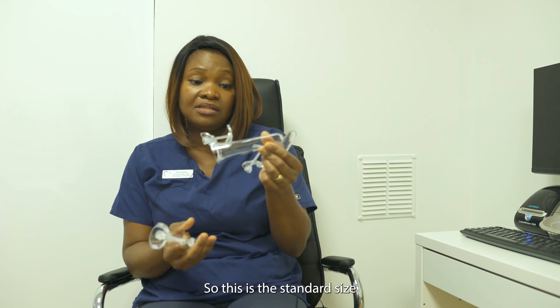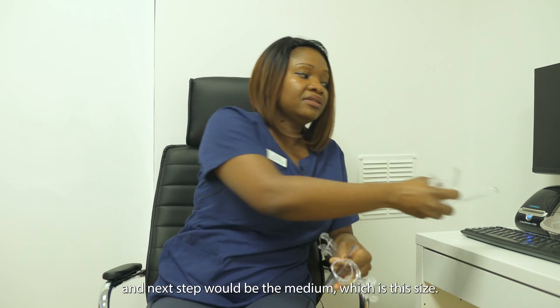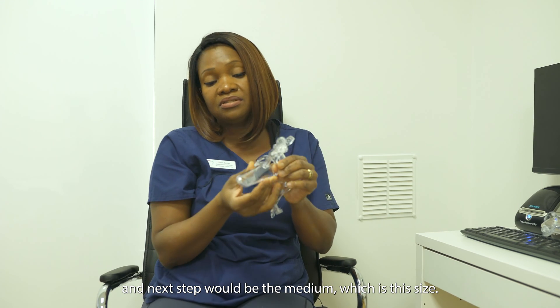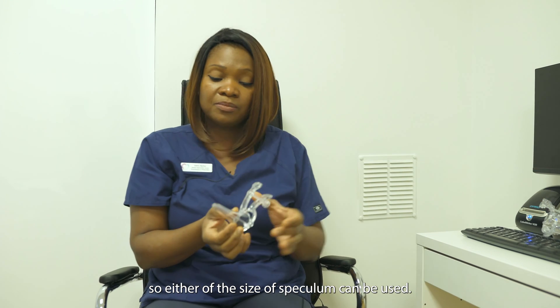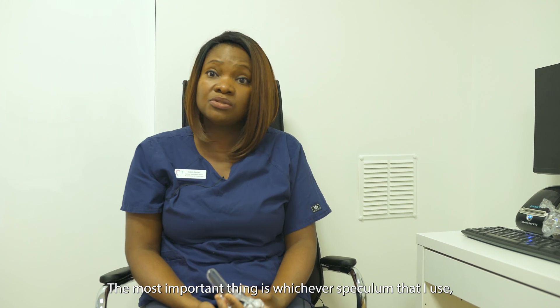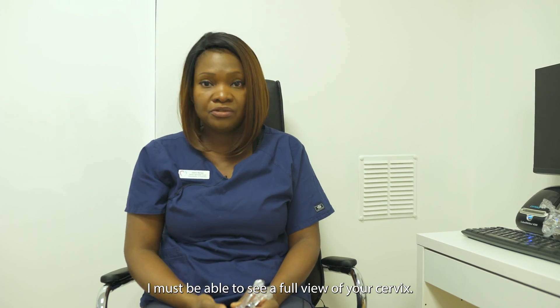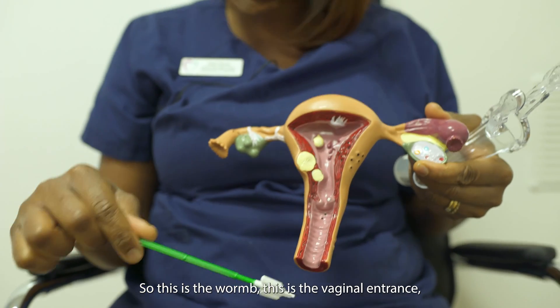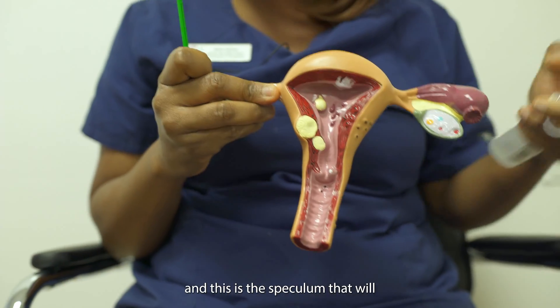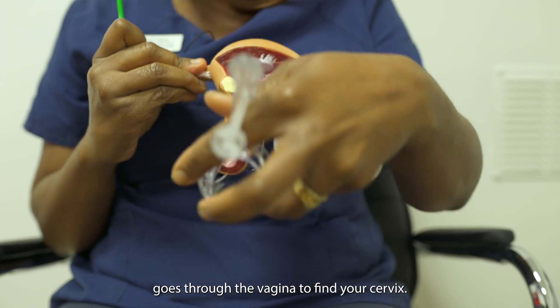So this is the standard size, and the next size would be the medium. Alternatively, this is the virgin speculum. Either size of speculum can be used. The most important thing is that whichever speculum I use, I must be able to see a full view of your cervix. This is the womb, this is the vaginal entrance, and this is the speculum that goes through the vagina to find your cervix.